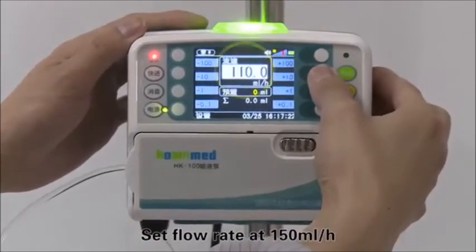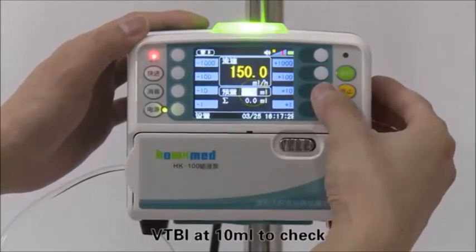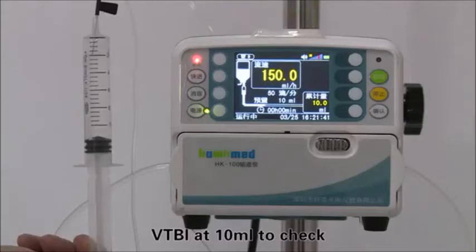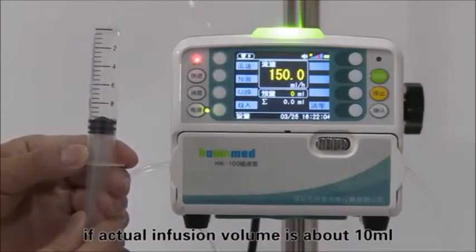Set the flow rate at 150 milliliters per hour and VTBI at 10 milliliters to verify that the actual infusion volume is approximately 10 milliliters.